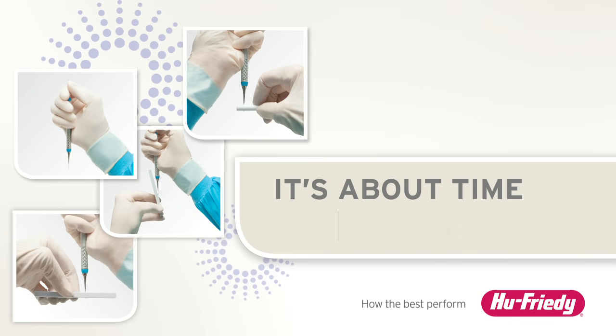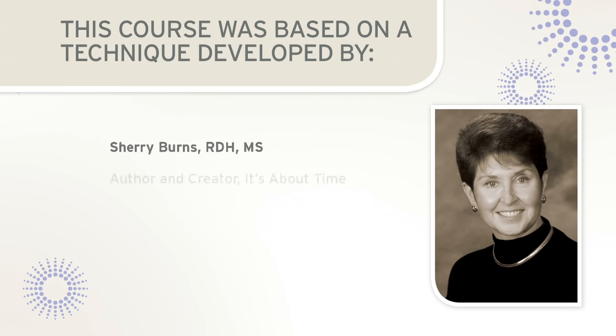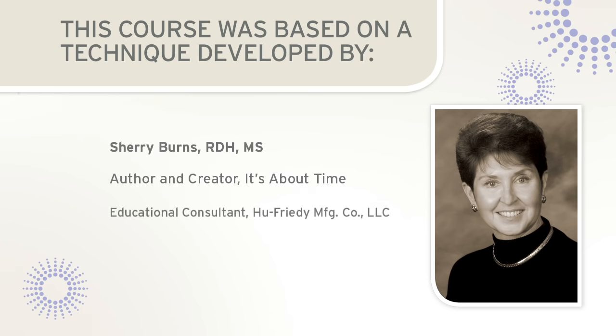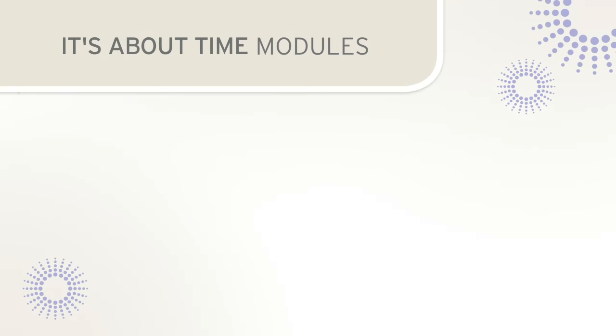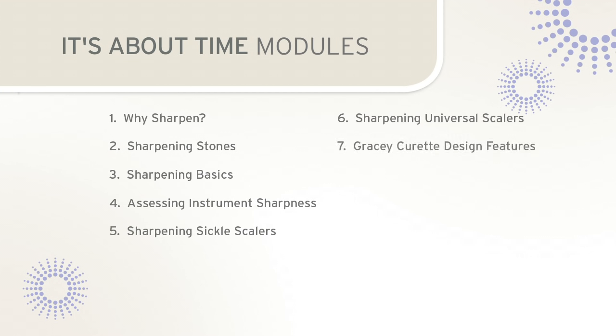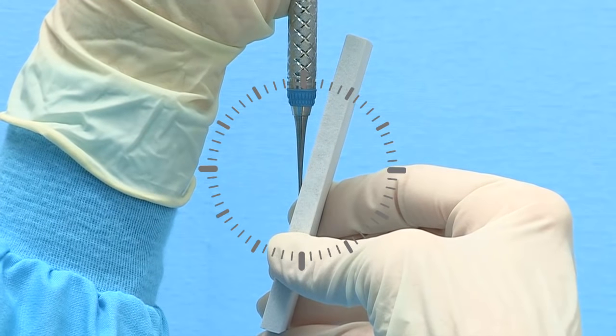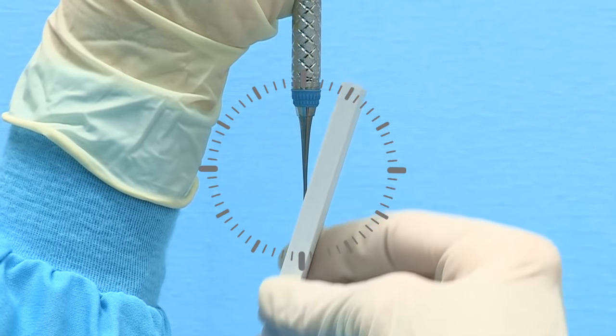Welcome to It's About Time, a classic technique for sharpening scalers and curettes. This method is based upon a teaching strategy designed and developed by Sherry Burns, author and creator of It's About Time, and educational consultant for Hu-Friedy Manufacturing Company. This approach to sharpening periodontal scalers and curettes will utilize the simple visual imagery of the hands of the clock to establish correct positions for sharpening a stationary instrument with a moving stone.